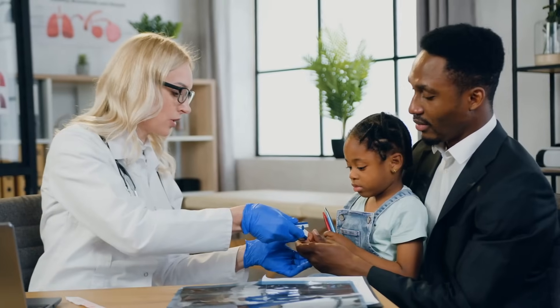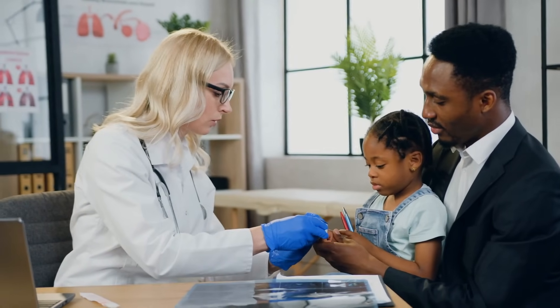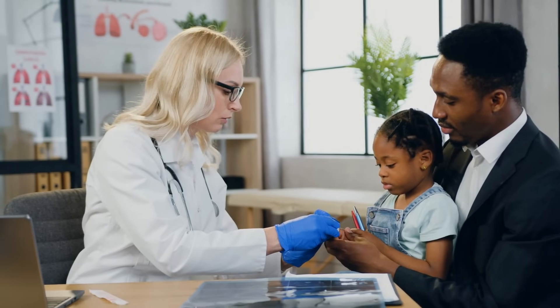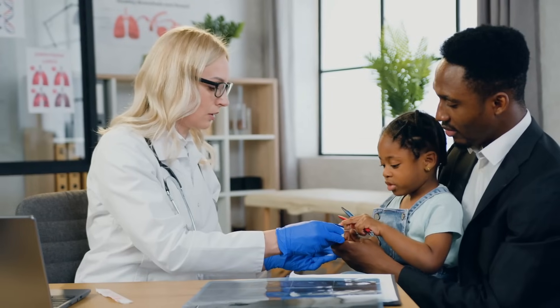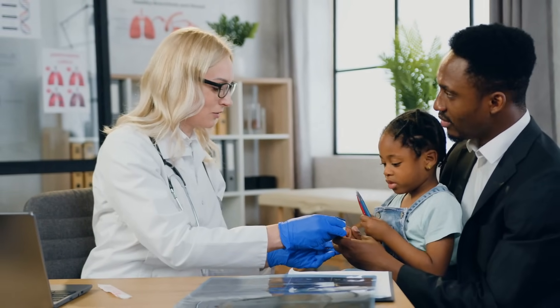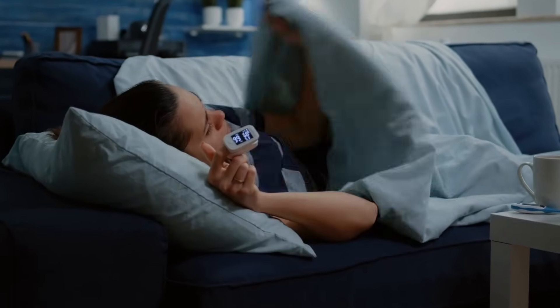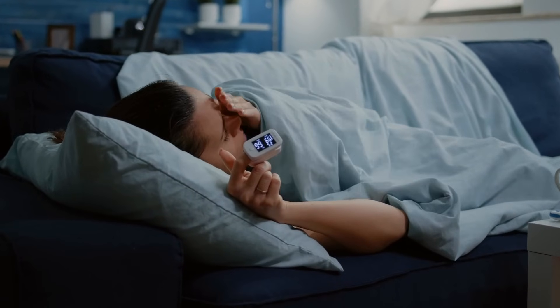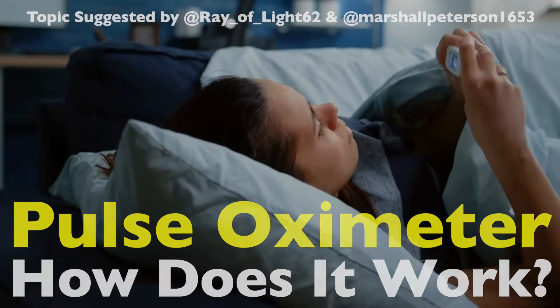Have you ever wondered how a tiny device clipped to your finger can reveal such critical health information? The pulse oximeter is a marvel of medical technology — small enough to fit in your pocket, but powerful enough to measure the oxygen levels in your blood. Its popularity surged during the COVID-19 pandemic, but its story and science go much deeper. Let's dive into how this ingenious device works and why it's so important.